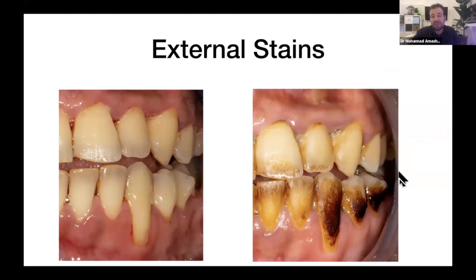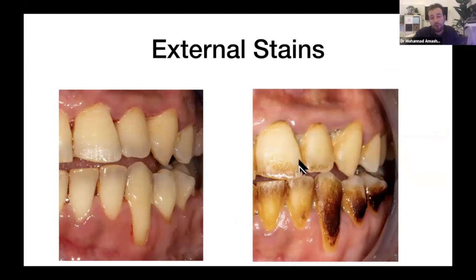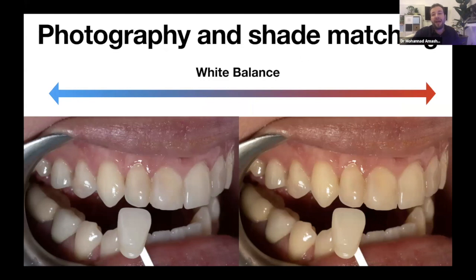Don't forget to remove external stains before shade matching — you can clean the teeth at the prior visit and the difference in appearance is dramatic. I like to use Profijet, a gentle powder that cleans the tooth surface very effectively. Let's talk about photography and shade matching, one of the most important tools in dentistry. Nowadays there are technologies allowing your lab to do shade matching just from a photo sent through software.